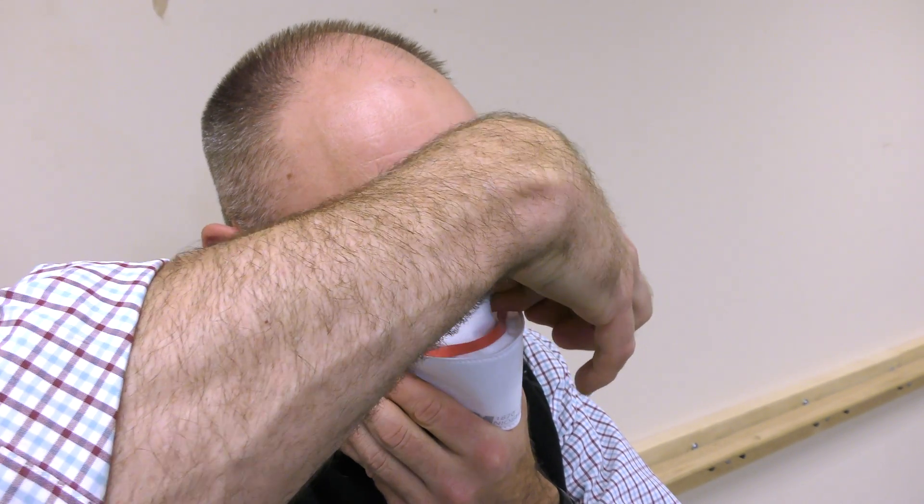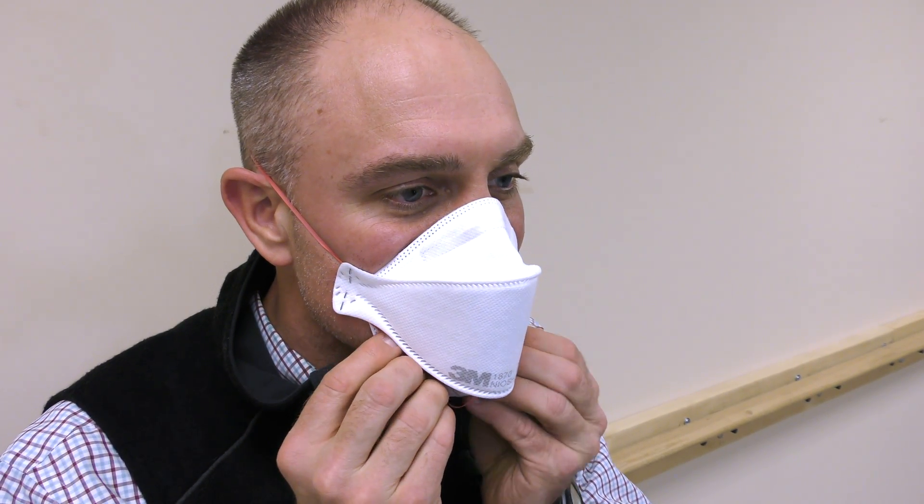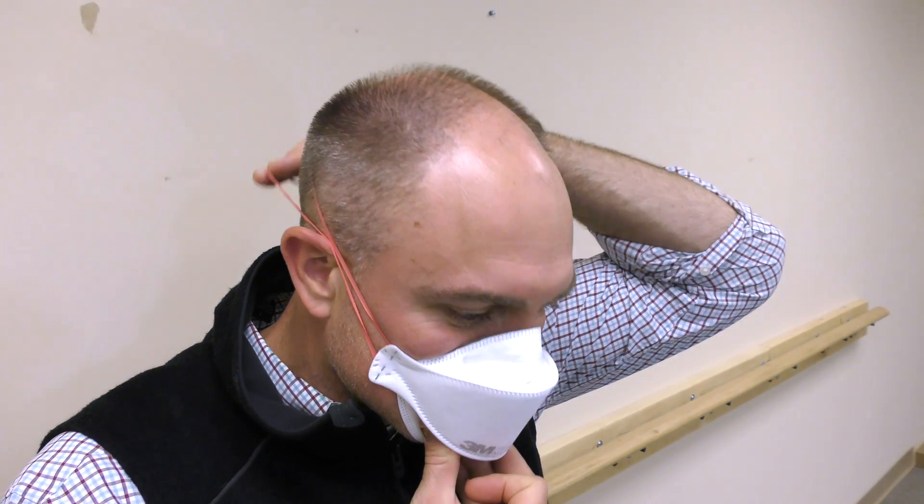Place the respirator on your face so the foam rests on your nose and the bottom panel sits securely under your chin. Pull the top strap over your head and position it high on the back of your head above your ears. While holding the respirator firmly on your face, pull the bottom strap over your head and position it around the neck and below your ears. Make sure the straps are not twisted for increased comfort.